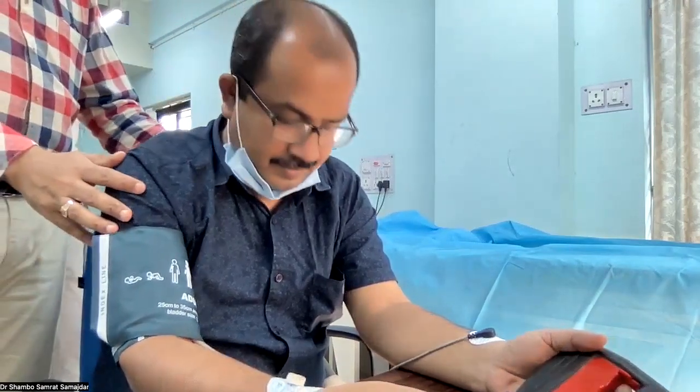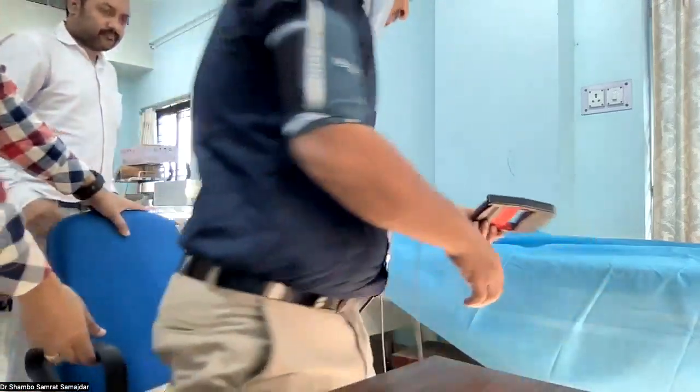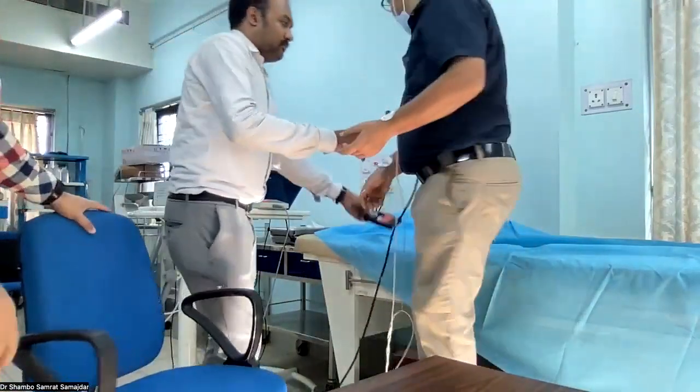Okay, it was done. Here the diastolic blood pressure was initially 77 millimeters of mercury, and after the hand grip it was 103 millimeters of mercury. So there is a rise of almost 26 millimeters of mercury, which is clearly more than 16 millimeters of mercury. So his diastolic blood pressure rises optimally, and he has good sympathetic nervous system function. So let's start the final test. Please come and lie down here.